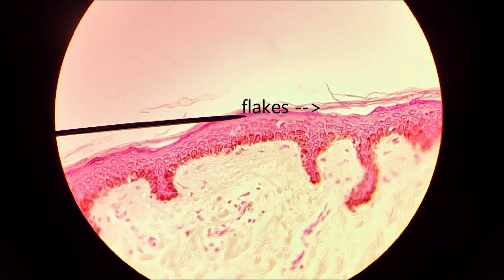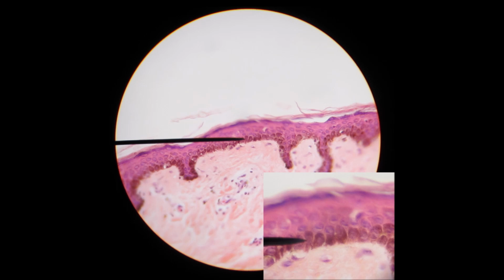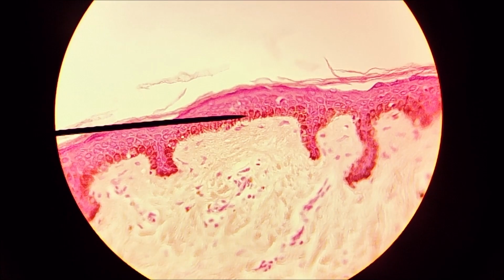Quite interestingly, you can see there's a dark line, kind of a brown line. You guys see this? It follows the lowest layer, a brown line all the way across. This is probably from a person with a darker complexion, so they're producing melanin. So this is that one little layer at the bottom and just above it that gives rise to human skin coloration, which is kind of fascinating.